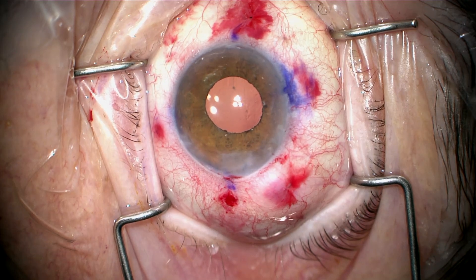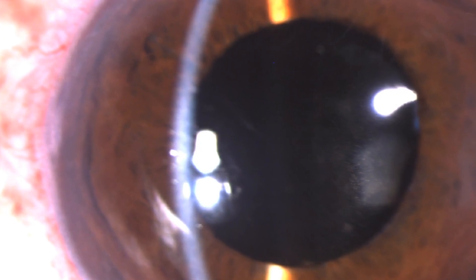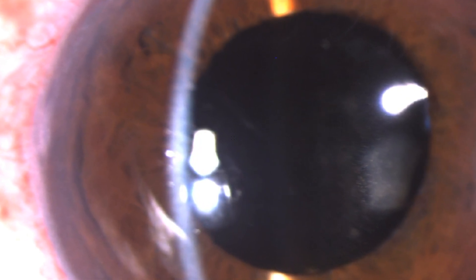Day one post-op, she was 20/20 with minimal correction. This is what she looked like at the slit lamp on day one. The lens is well-centered and secure. She's very happy. Thank you for your attention.